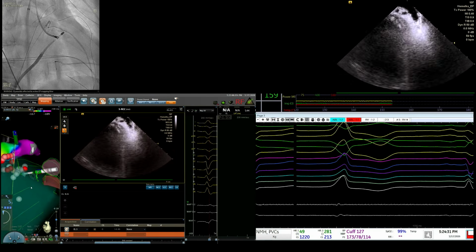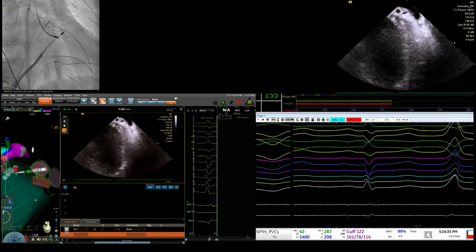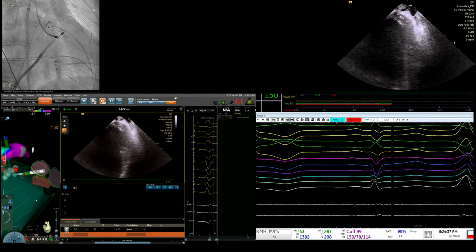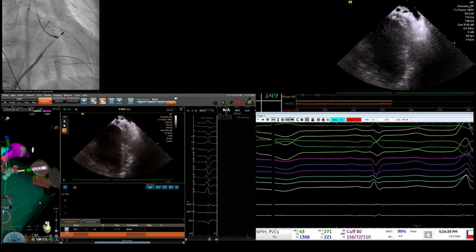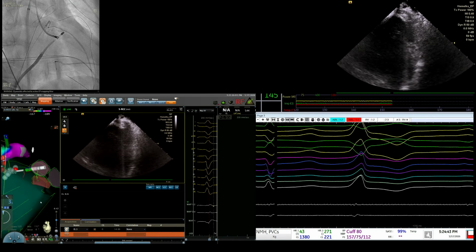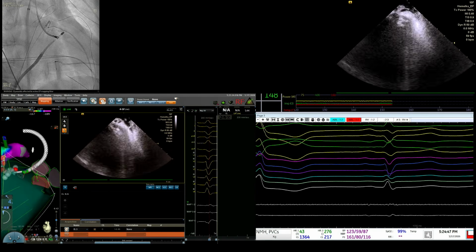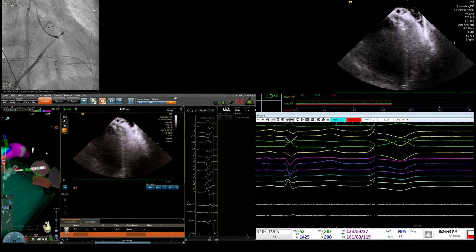So left coronary cusp would be one. LV, of course, would be another one. Epi, we ablated from the epi. But at this point, you go back to the drawing board, and you start from the beginning, and you map this one the same way we mapped the other one to try to figure out where would be the next place, because there is a variation on the EKG. The EKG looks different.